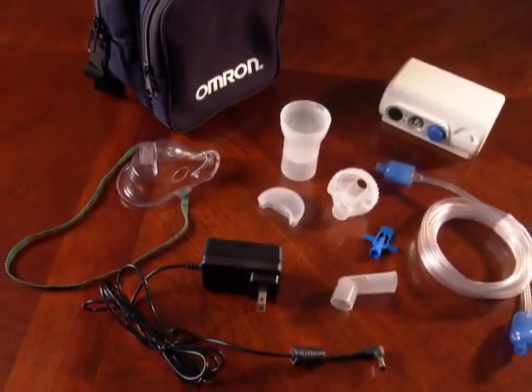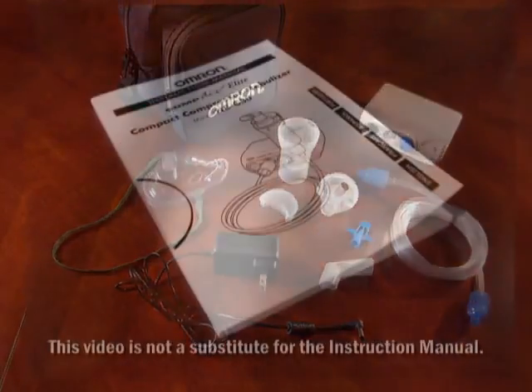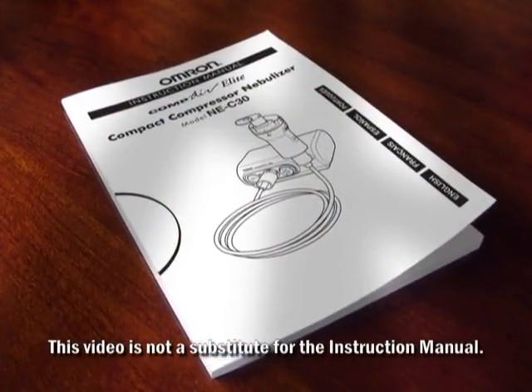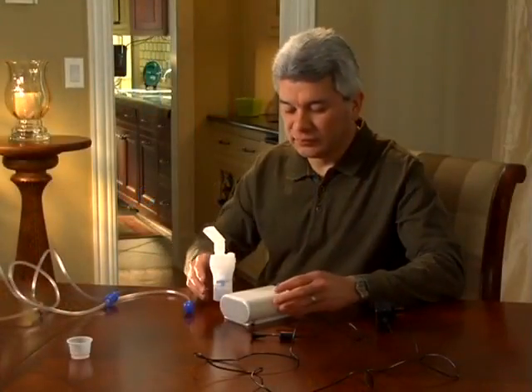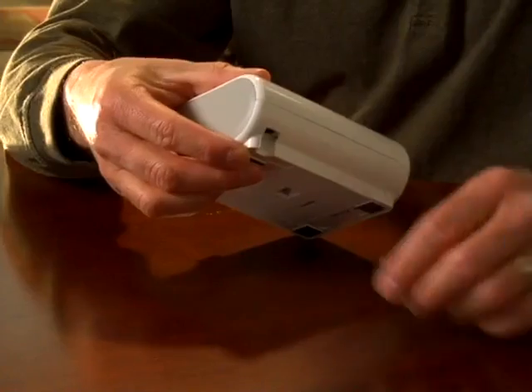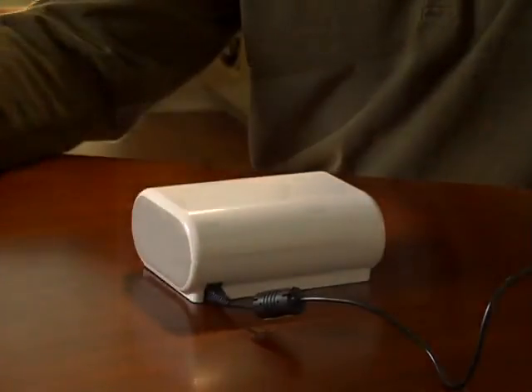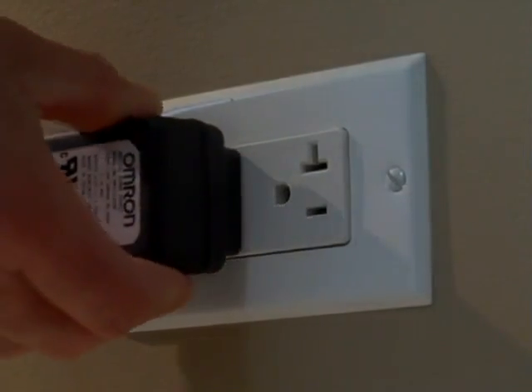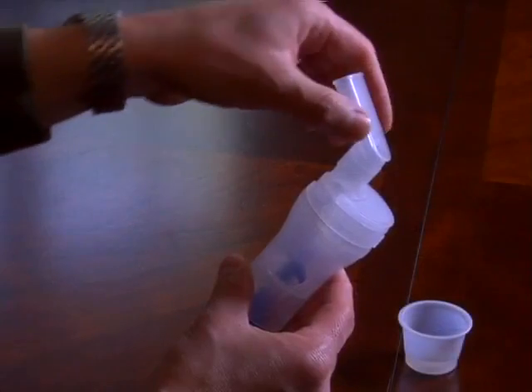If you have any questions about your Omron NEC30 Compair Elite Compact Compressor Nebulizer, refer to your instruction manual first. To get started, set your nebulizing system on a level surface near a comfortable place to sit. Plug the AC adapter connector into the power connector on the compressor, then plug the power plug into a power outlet. Remove the mouthpiece and cap from the nebulizer kit.